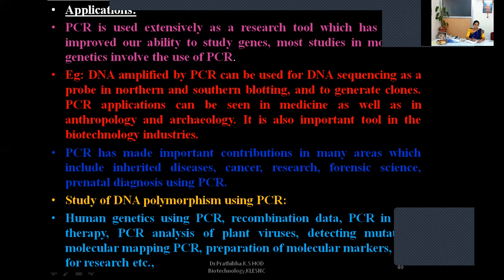To detect whether a person is suffering from COVID-19 or not, first they take a swab. They take this swab from the throat, and a nasopharyngeal swab will be collected. These swabs are collected in a sample collector, which is called a VTM. The collected sample will be transferred into the VTM, that is viral transport medium, and then transported to the laboratory. How do they take the sample? By using a long stick like an earbud, they take the sample.